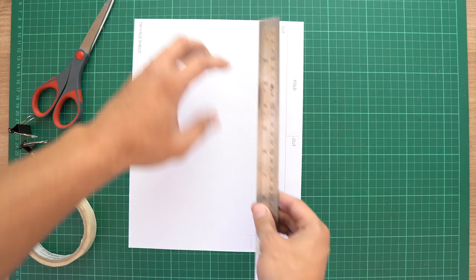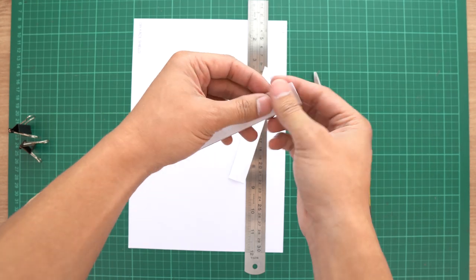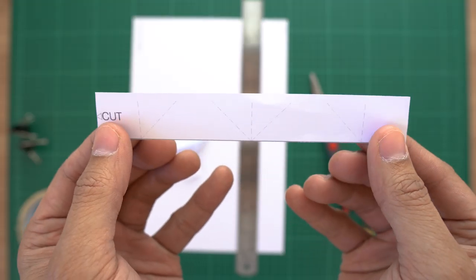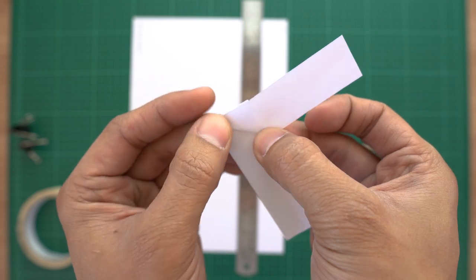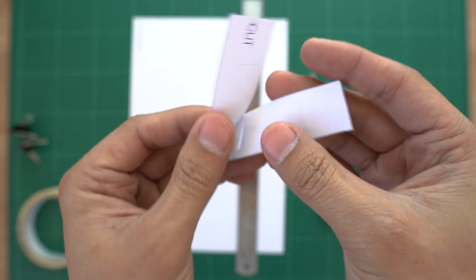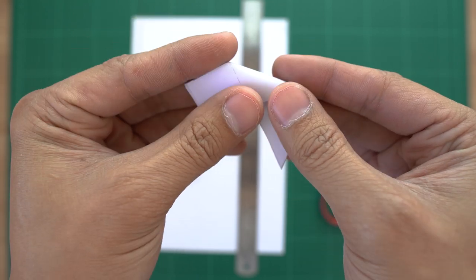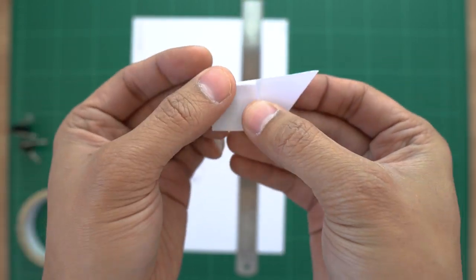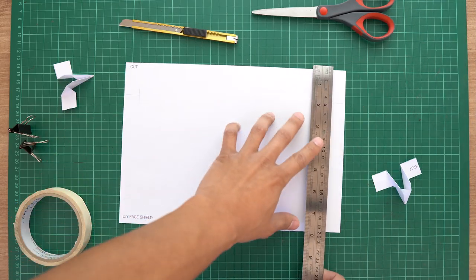Anyways, begin by cutting a two-centimeter-wide strip from the long side of your PVC sheet. Now divide that strip into two — like so. These two strips are going to be the flaps that we clip onto the side of our cap. Just follow this video of me folding one of the strips, and once you're done with one, repeat the same process with the other strip. Now all we have to do is tape this piece at least four centimeters from the top of your PVC, or you could just refer to the PDF you printed.